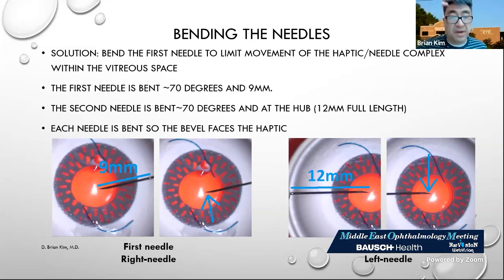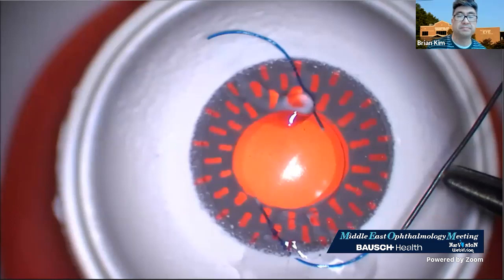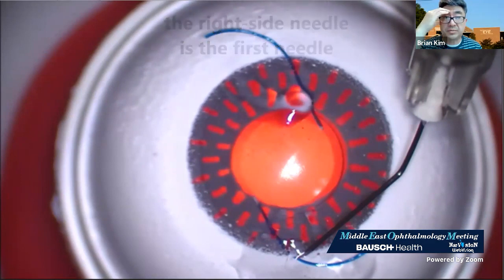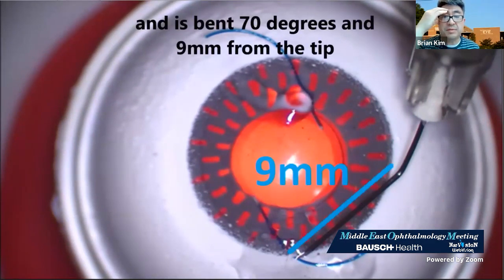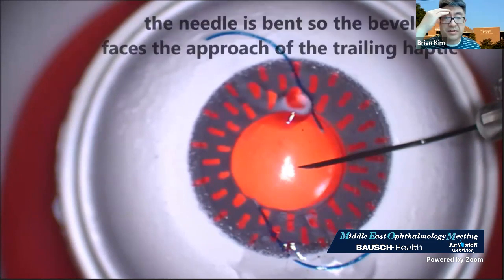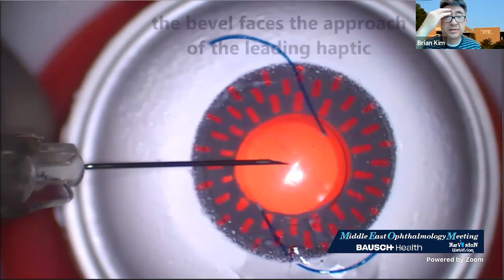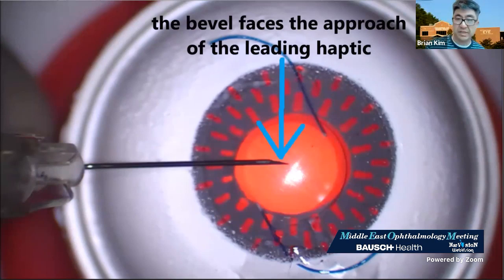The needle is bent so the bevel faces the haptic. And so in this case, the right needle is facing towards the trailing haptic, down, and the second needle, the left needle, is facing towards the leading haptic, which is up in the slide here. And so again, illustrating the bending. The right side needle is the first needle, and it's bent 70 degrees, 9 millimeters from the tip. And you see the bevel is facing towards the approach of the trailing haptic. The left side needle is bent 70 degrees and full length, and the bevel faces the approach of the leading haptic.